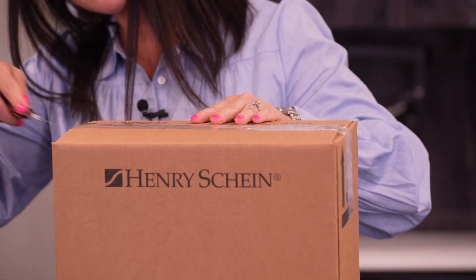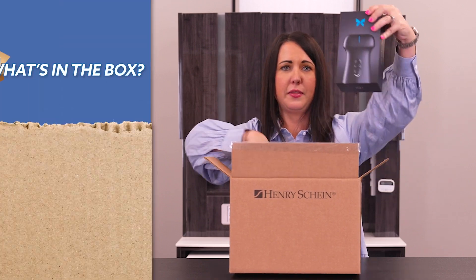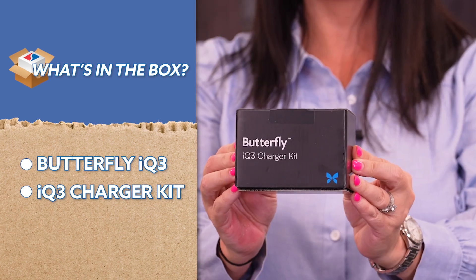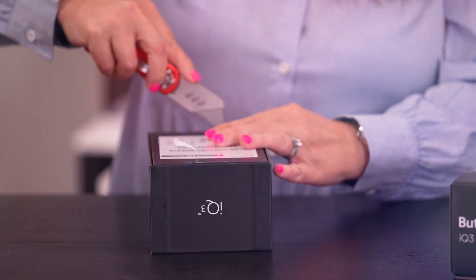I can't wait to see what's in this box, guys. We've got two boxes in here — we've got the Butterfly IQ3 and the Butterfly IQ3 charger kit. So let's open this up and see what's inside.